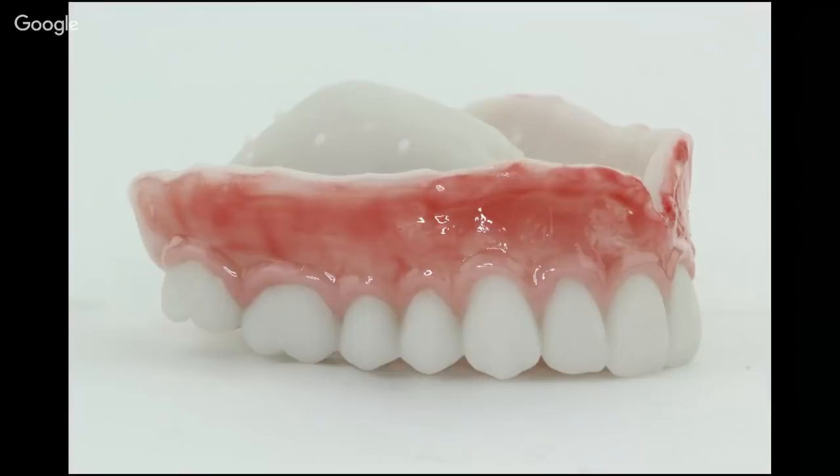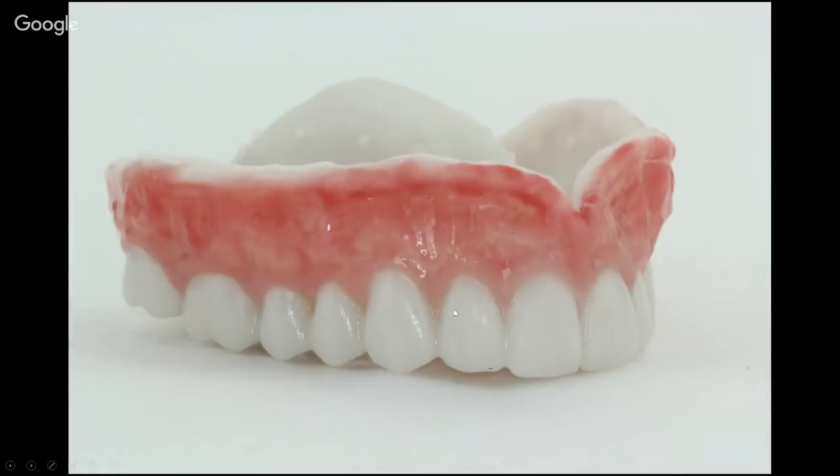And so I literally just took it and I ran a bead of it all around the teeth, right at the necks. It's a pretty good stiffness to the material, and so it will maintain that thickness without spreading and thinning itself out. And so it's beginning to take shape now. I took a little thin endo file and drug it up into the embrasures to extend this peak. That's how I got that. And now going back with the translucent pink over the top of all that.